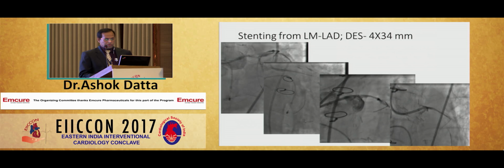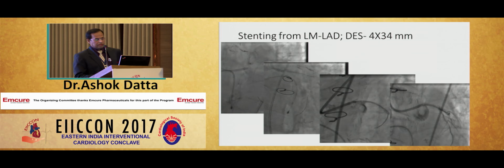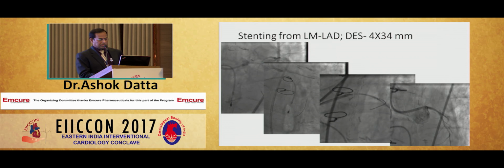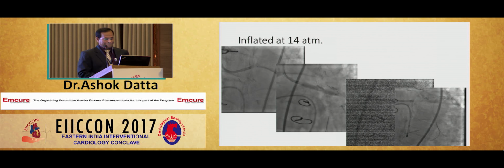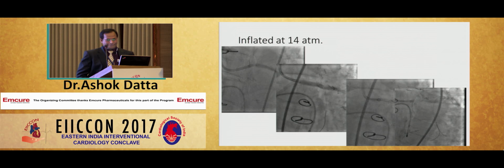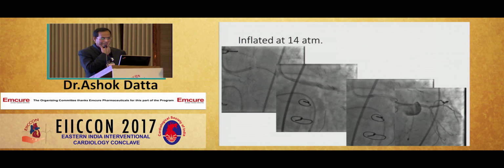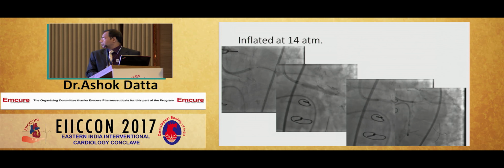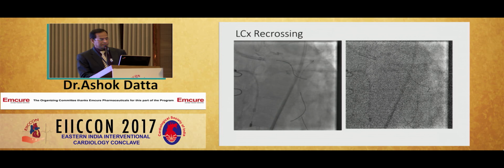In cranial view, the ostium of the left main is stented. Inflated at 14 atmospheres. So this is the result. LCX is recrossed.